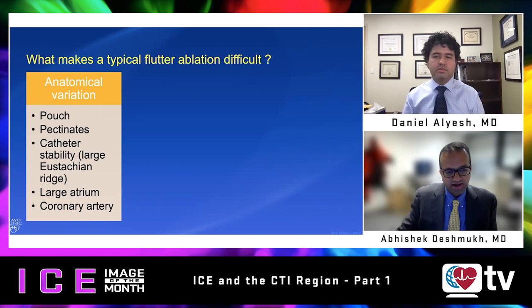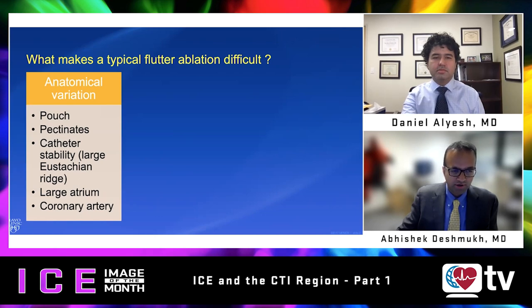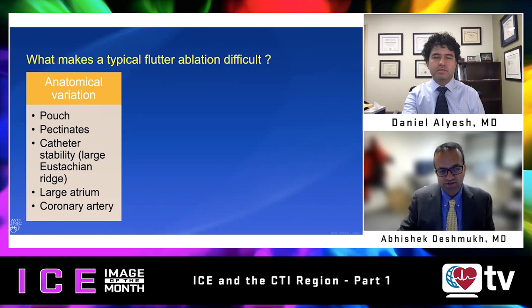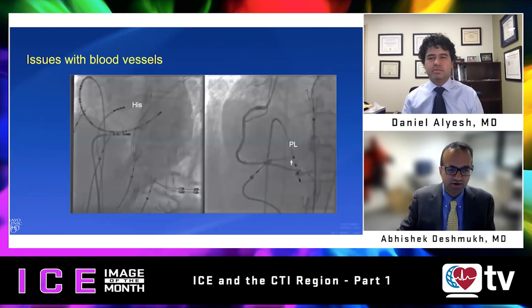Generally you would expect the CTI to be like a straight line and a smooth highway, but there are definitely going to be some potholes. Sometimes these typical flutters become somewhat difficult to ablate — you can encounter pouches, you can encounter prominent pectinate muscles, catheter stability can be an issue, there can be a severely dilated right atrium, or proximity to blood vessels including coronary arteries and small cardiac veins.